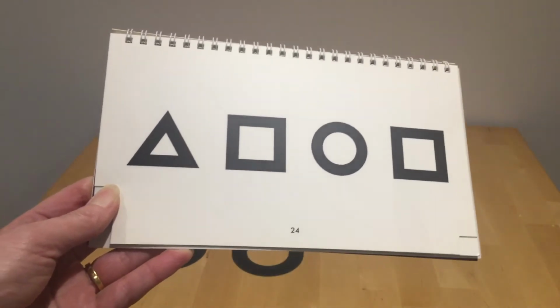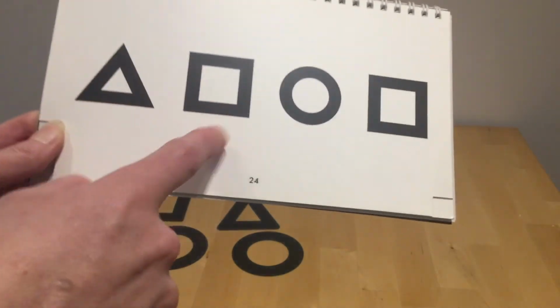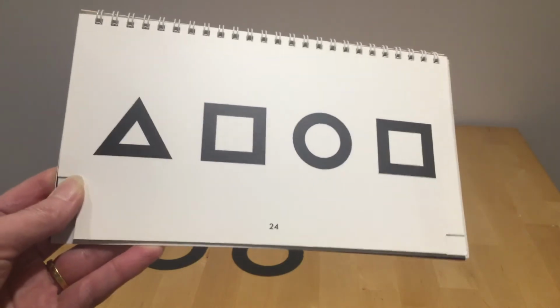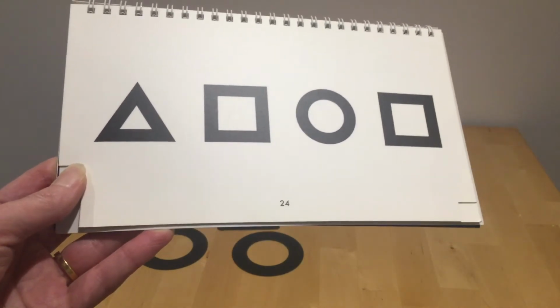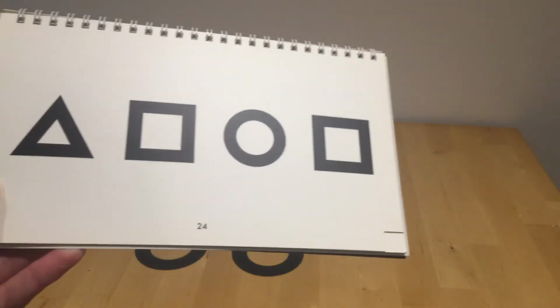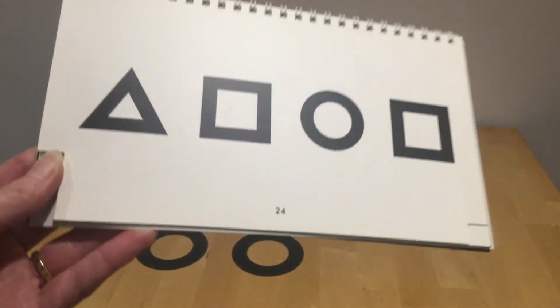If you do something like that, always choose one of the symbols that's in the middle. Because of crowding, it's much easier to see the ones at the end, and it's often the ones in the centre that the child or young person will get wrong. So I just quickly move on.